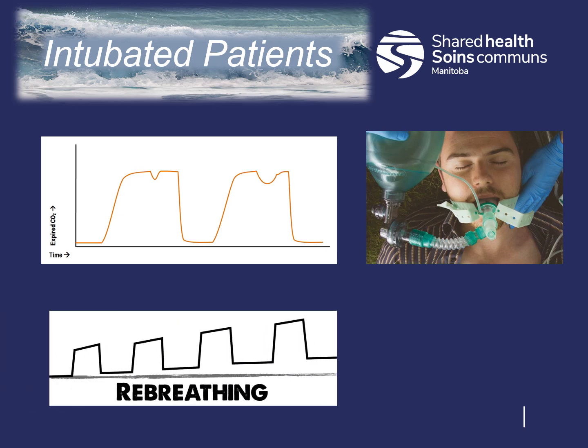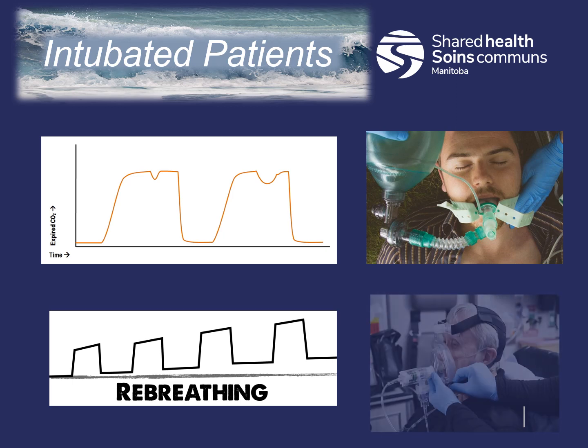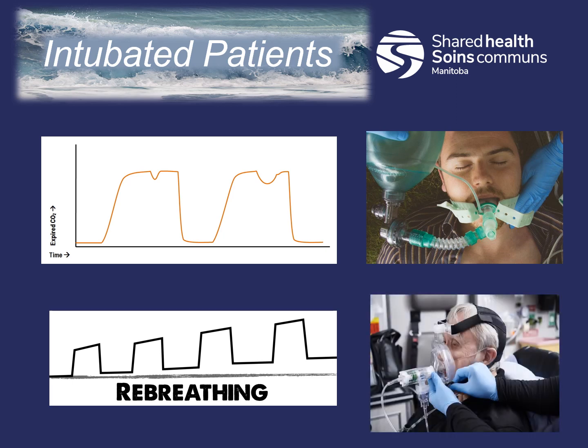We also look into the rebreathing pattern. Not only intubated patients, but patients on NRB and on CPAP as well, run the risk of having CO2 re-enter the breathing circuit. There will be a rise in the waveform baseline as not all the CO2 is being exhaled. This is most common in intubated patients, but possible to be observed in patients being treated with CPAP.